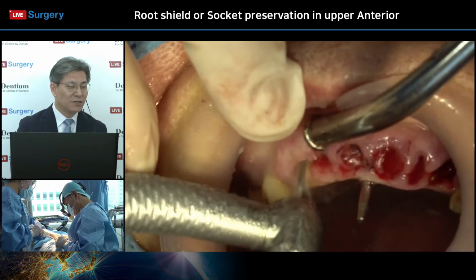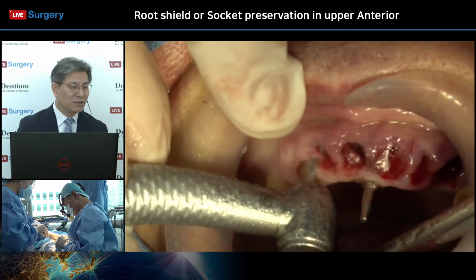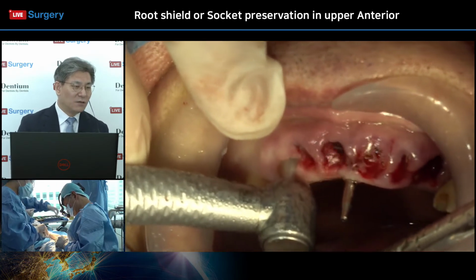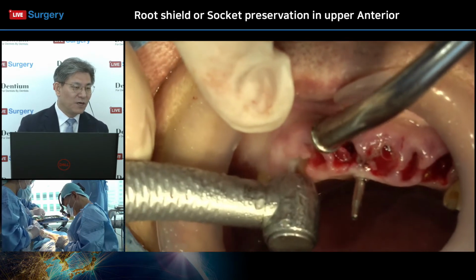Any other touch is not given when you're using the Fisher bar, right?